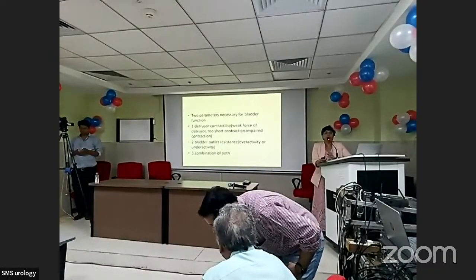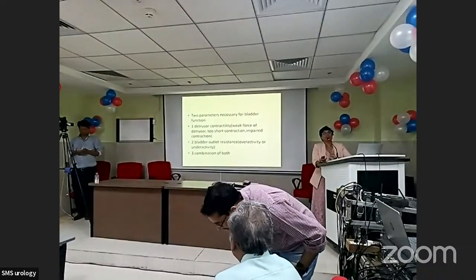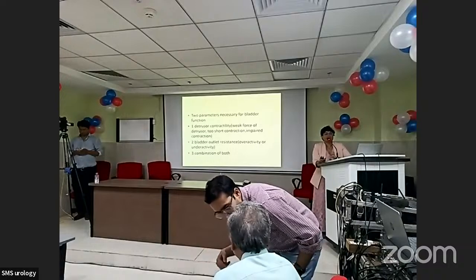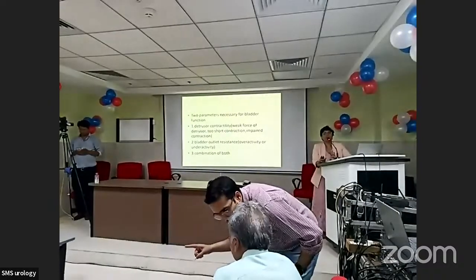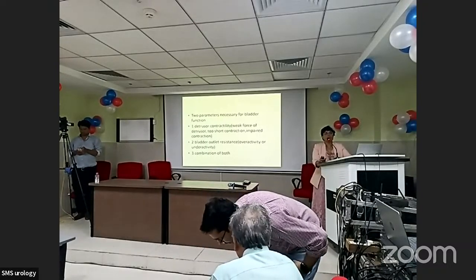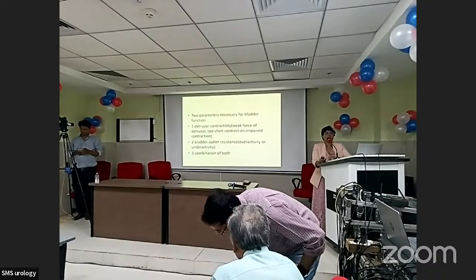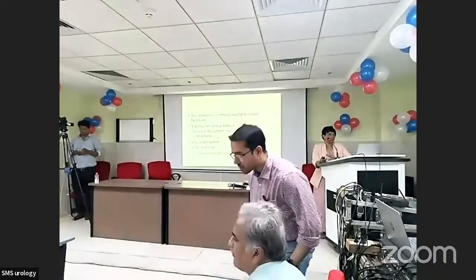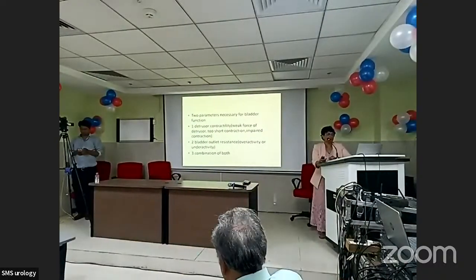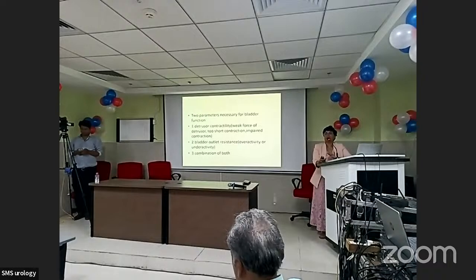For the bladder to function, we need the detrusor to contract. It's as simple as that. And we need to measure the bladder outlet resistance. So there are two things we need to measure: does the detrusor contract, and is there outlet resistance? Now the detrusor contraction may have various types of problems. The force of contraction may not be adequate, it may be too short a contraction, or it may be totally impaired, or it may be an acontractile detrusor. So we need to diagnose only 3 things for the detrusor.